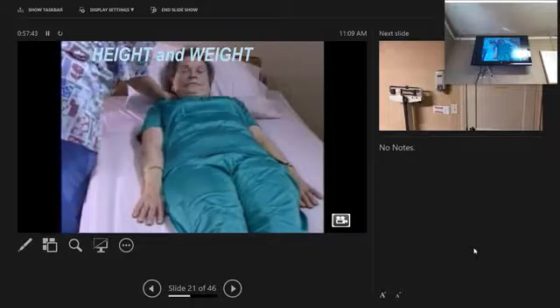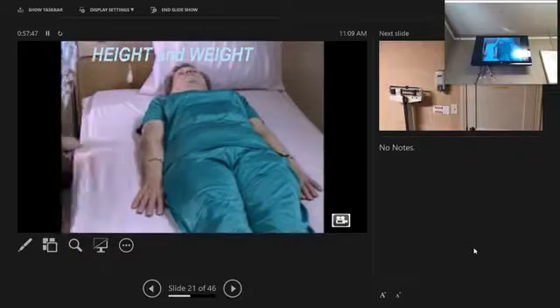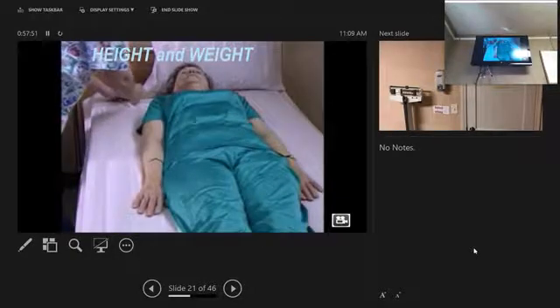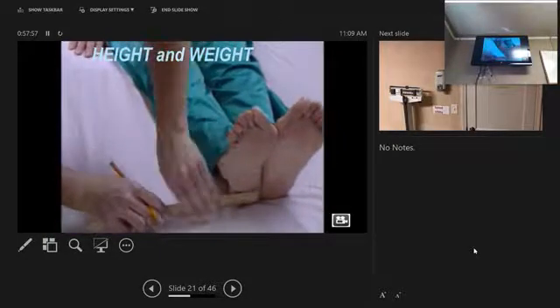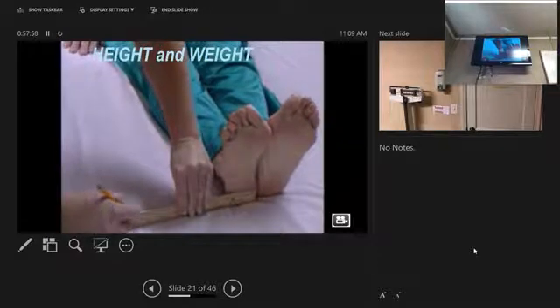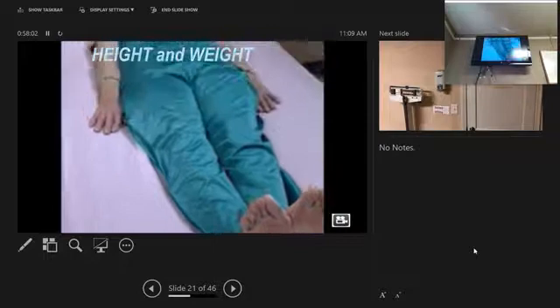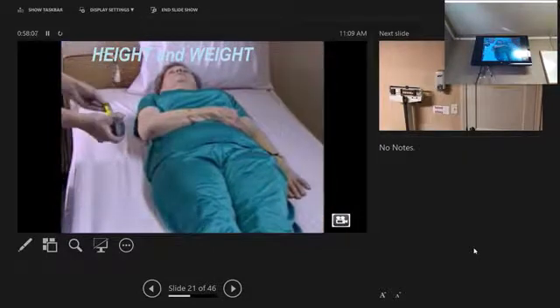Remove the pillow and straighten and tighten the bottom sheet. Make a tiny mark on the sheet with the pencil at the level of the resident's head. Replace the pillow. Make a tiny mark on the sheet with the pencil at the level of the resident's heels. Turn the resident on his or her side so the marks on the sheet are visible.